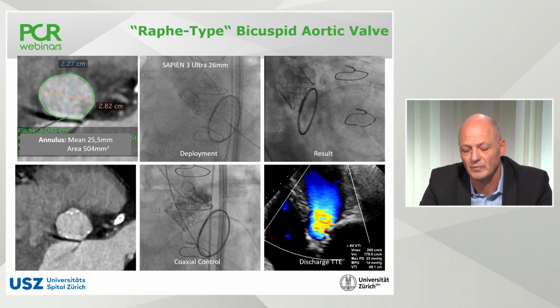And this patient with a mitral ring, you'll be bringing back for a transseptal procedure? So we know that it's now approved also in Europe for the mitral position. Yes, maybe one day in the future.